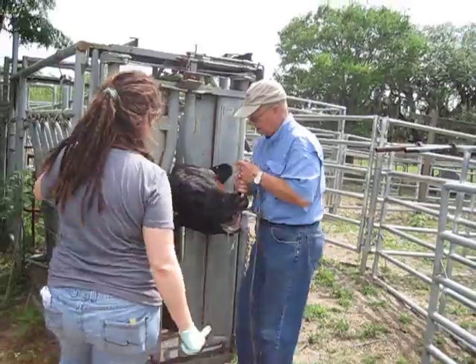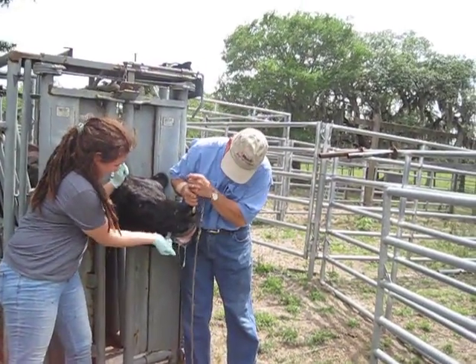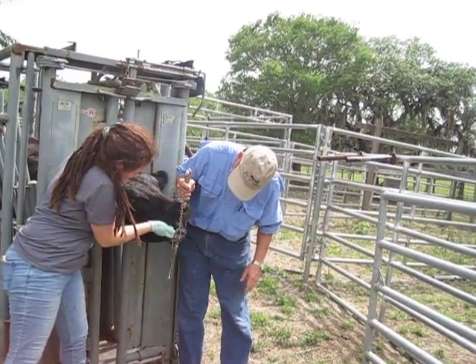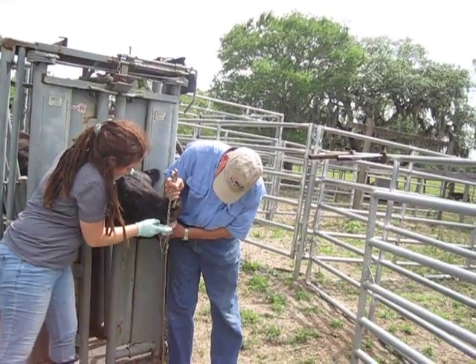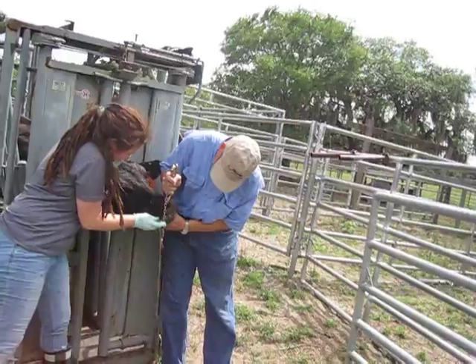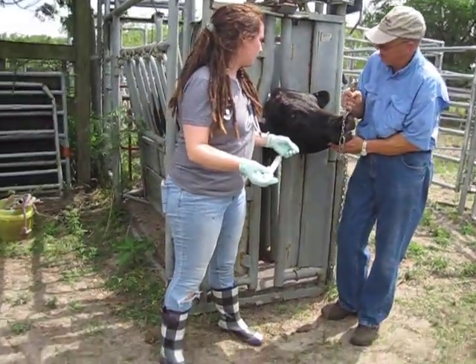So we can come from all this. No, no, no — yeah, we got it. You just got to hold it.